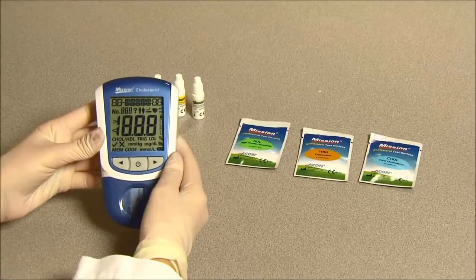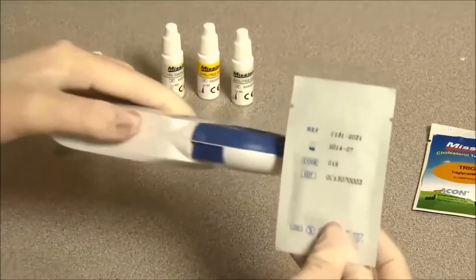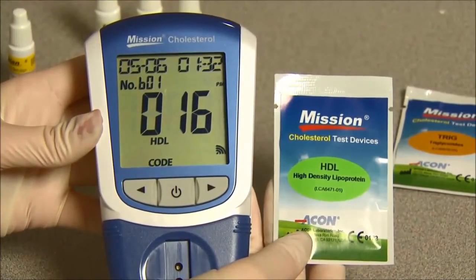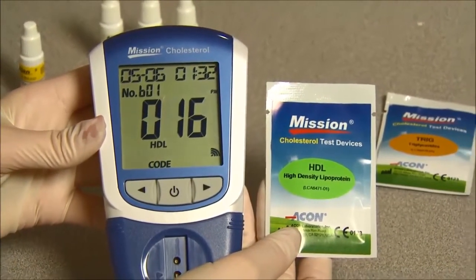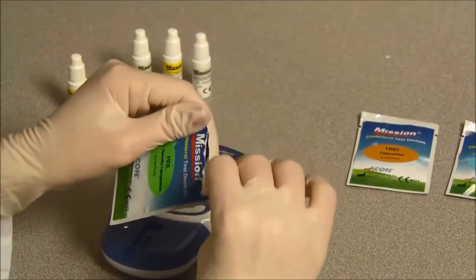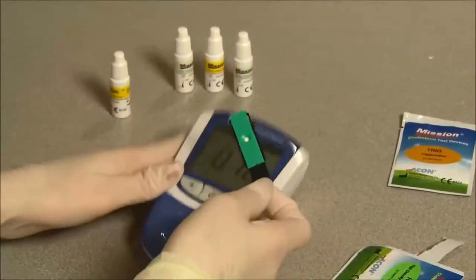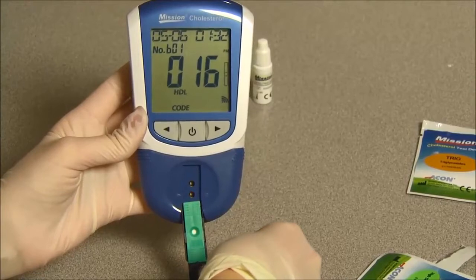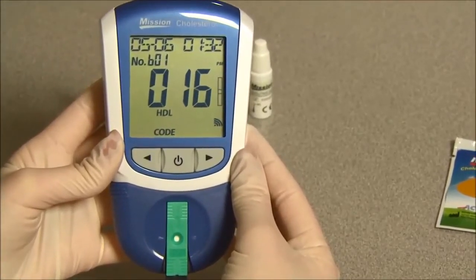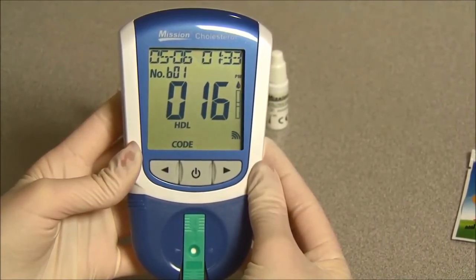First, turn on the meter. Check that the code chip number on the LCD screen matches the inserted code chip. Make sure the sample type displayed on the meter LCD is BL; if not, set the sample type to BL. Refer to the User's Manual for details on specimen type setup. Wait for the meter to flash the test device symbol, then insert the test device completely into the test device channel in the same direction as the arrows printed on the test device. While the meter is flashing the blood drop symbol, apply a drop of Control Solution to the specimen application area of the test device.